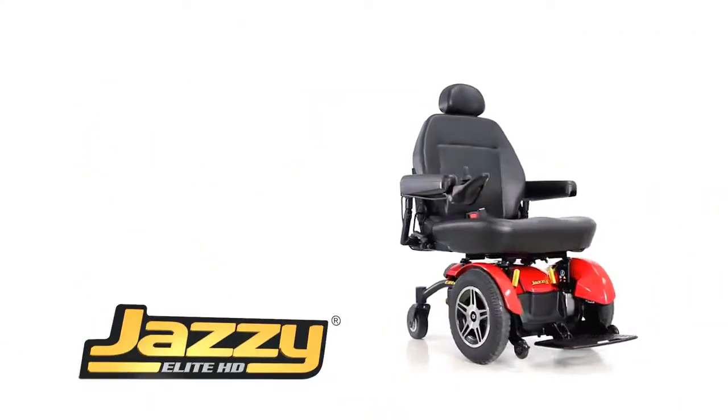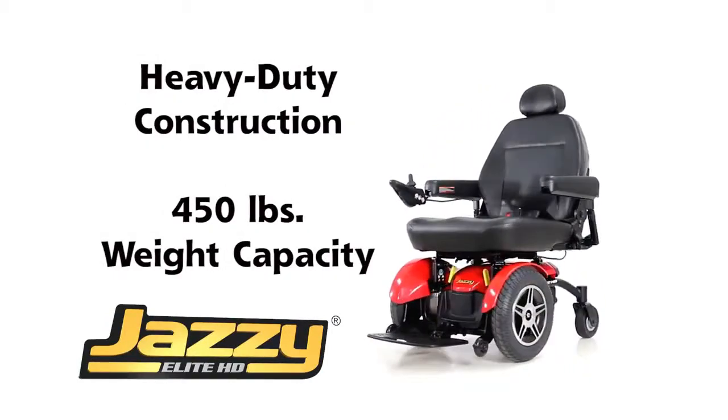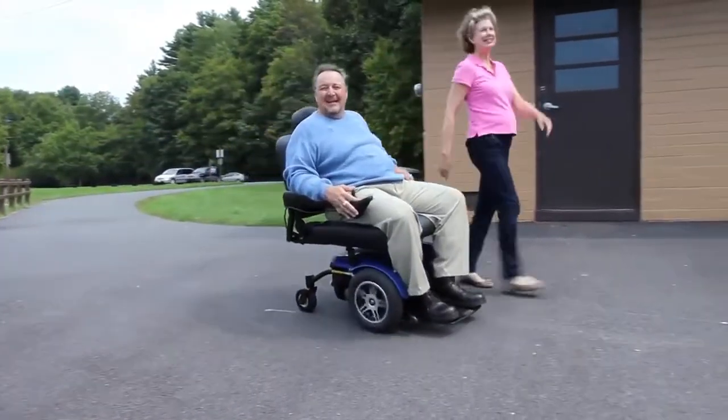The Jazzy Elite HD Power Chair offers heavy-duty construction, a 450-pound weight capacity, and excellent performance in a stylish, highly maneuverable package.